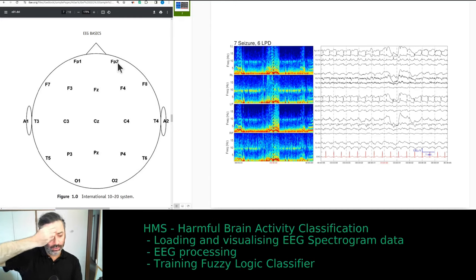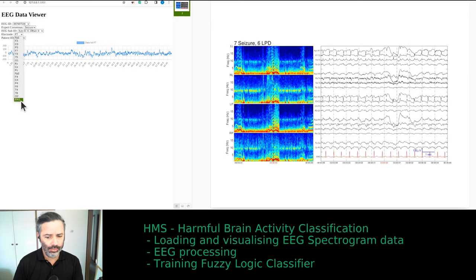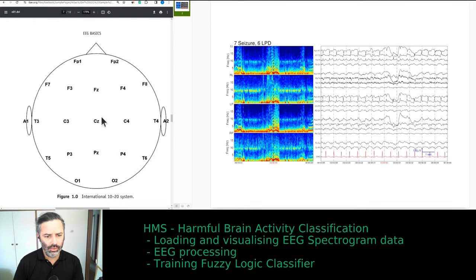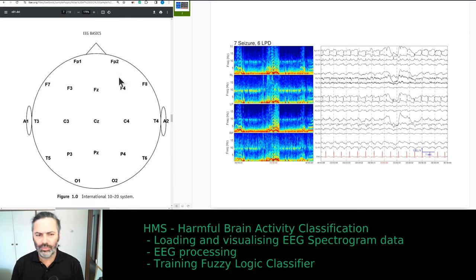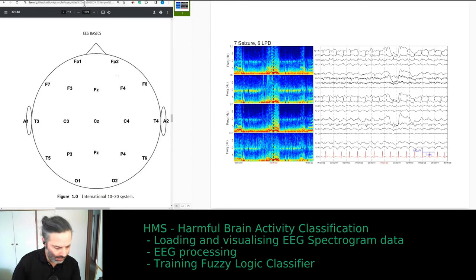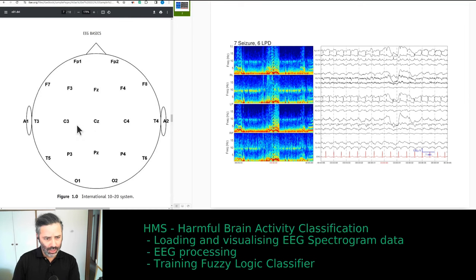Bringing up the standard EEG montage from the International League Against Epilepsy: FP1 minus F7, F7 to T3, T3 to T5, T5 to O1, FP2, and so on — these are digitally subtracted from one another. I never understood why you need to do that. You do it to reduce the number of channels displayed, but in big data analysis it's not necessary. You can essentially display just four regions of the brain, though for big data analysis the full montage isn't required.